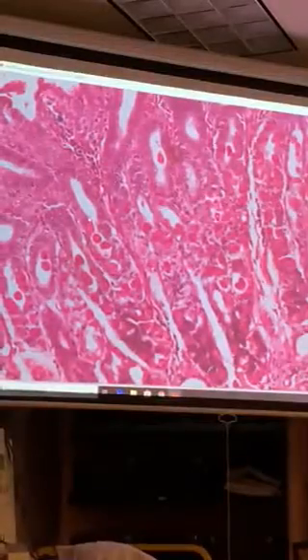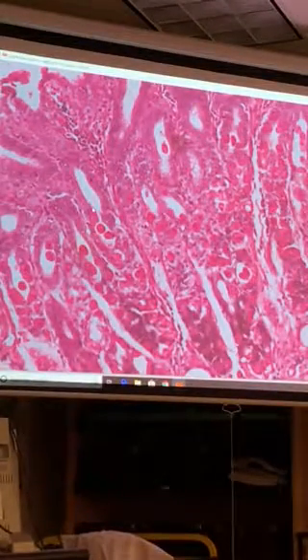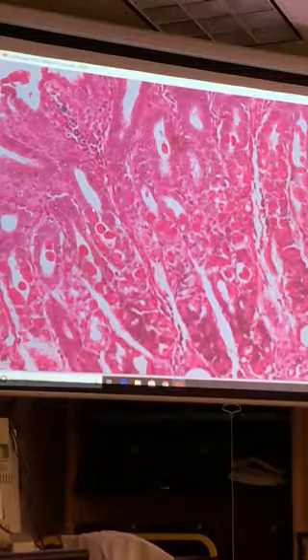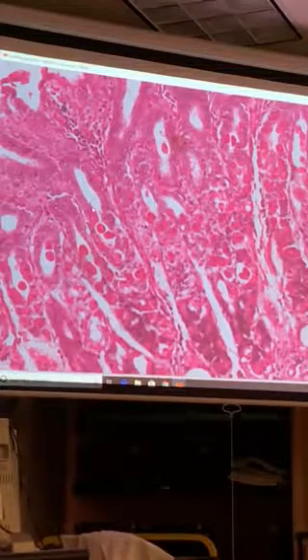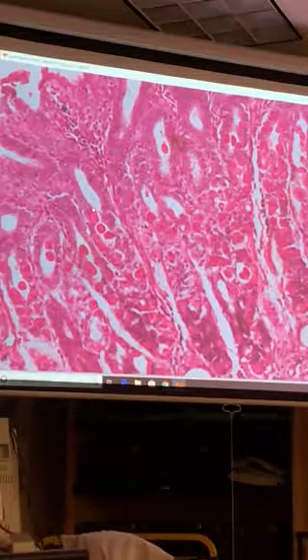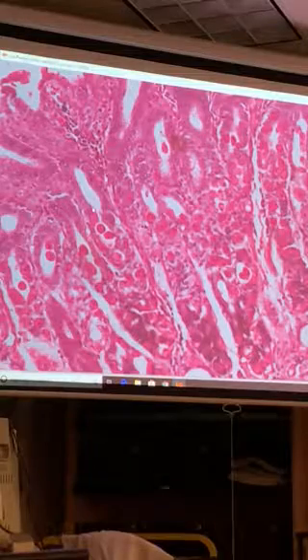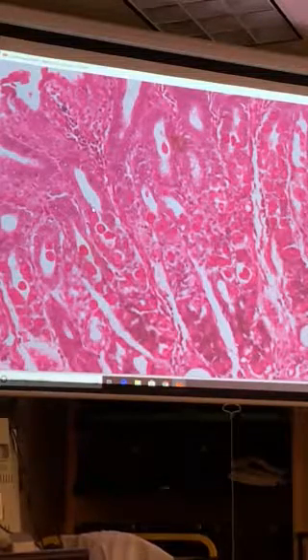You follow those pits down. These structures are not up here. They're going to be down in the pits. So we see these cells are part of it here, here, here. We have areolar tissue all around it as well. But if we consider these cell structures all together, we call these what? Gastric glands. Yeah.